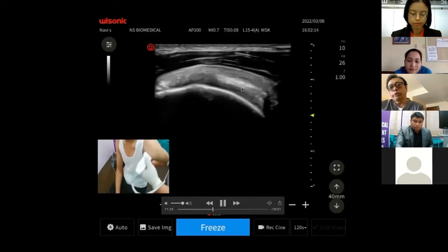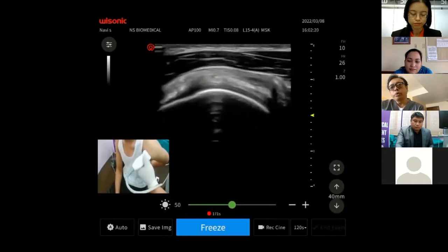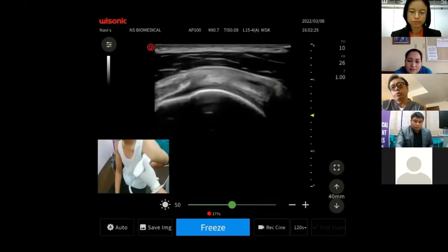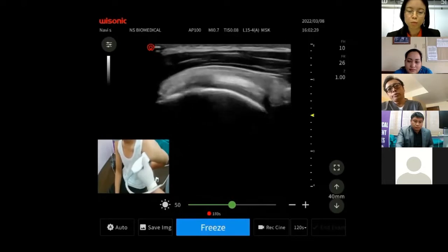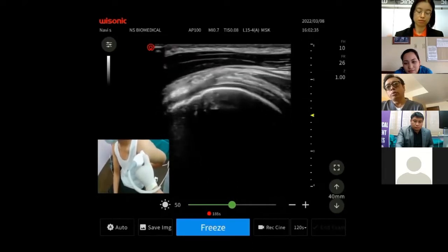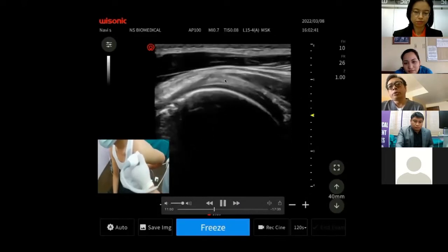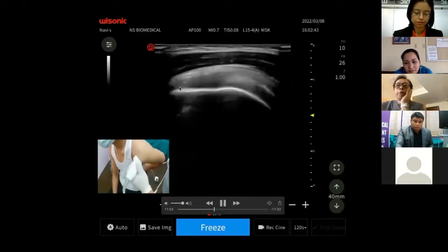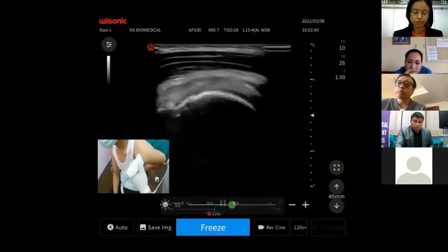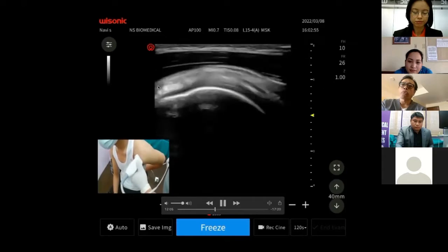After counting our layers, we have to scan the supraspinatus muscle and tendon in the whole of it. So we scan it superiorly to inferiorly, anteriorly to posteriorly, all the way. And as we scan the supraspinatus muscle posteriorly, we can see the infraspinatus tendon coming into the picture. Both the supraspinatus as well as the infraspinatus go on and insert to the greater tuberosity. Scanning posteriorly might be a little confusing for identifying the infraspinatus tendon, so there's an easy way of doing it.